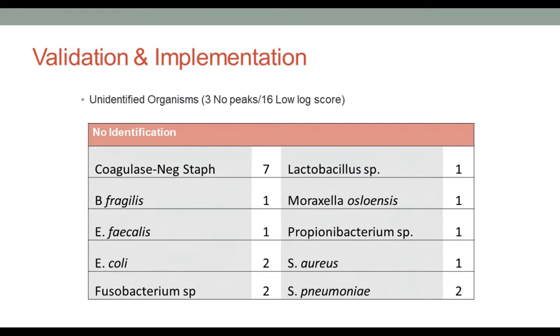For validation, can you use blood culture aliquot at -80 degrees within 8 hours of being unloaded from blood culture instruments? Well, we did not try that, so I'm not sure what effect that would have on these organisms. Of course, when you freeze organisms, that can kind of damage them a little bit, and so it may be possible. We just didn't try that when we did our validation study.